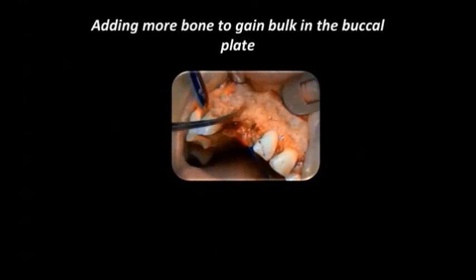As you can see, we have plenty of bone using that bone collector, and plus you increase the bone with the allographic bone that I used as well. I over augment usually because we expect some kind of resorption in that area, so we over augment, put some extra bone, make sure that if there is some resorption, you will still have enough thickness of the buccal plate, which is 2 mm. So I over augment all the time in order to make sure that even if there is resorption, we still have more than 2 mm on the buccal side.